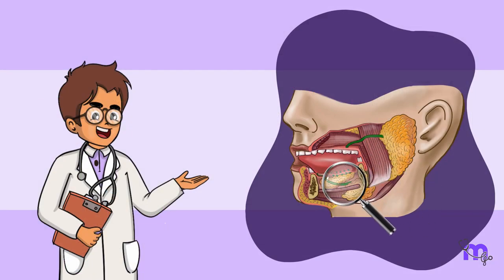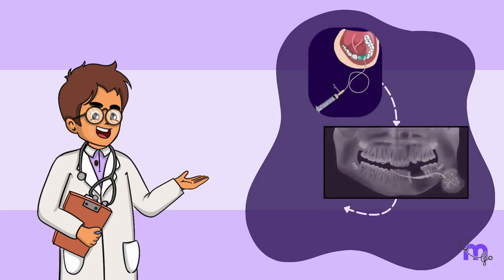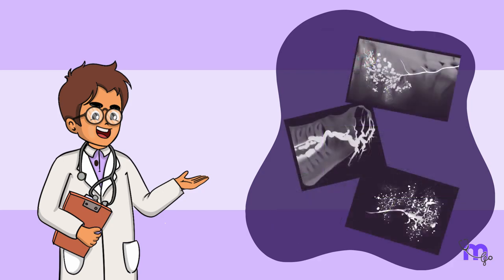Thus, sialography offers a minimally invasive way to examine the salivary glands and ducts. By injecting a contrast agent and taking radiographs, dentists can gain valuable insights into potential blockages, abnormalities, or malfunctions. This information is crucial for diagnosing and treating various salivary gland conditions.